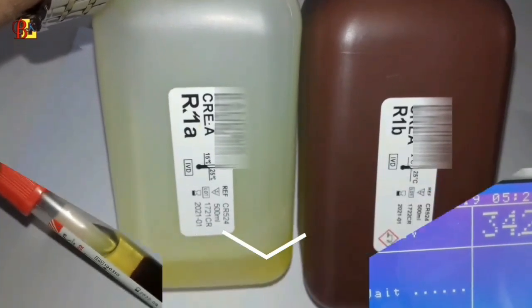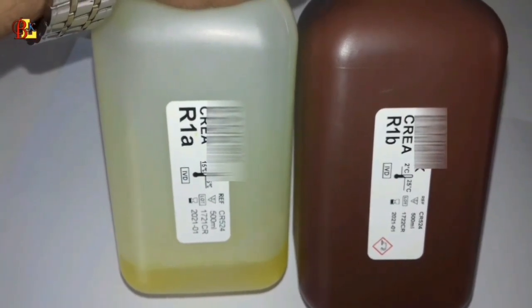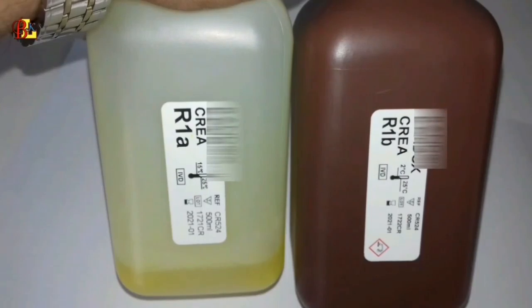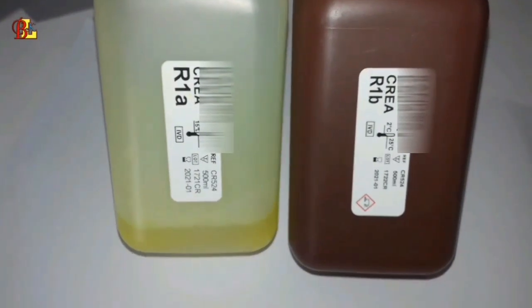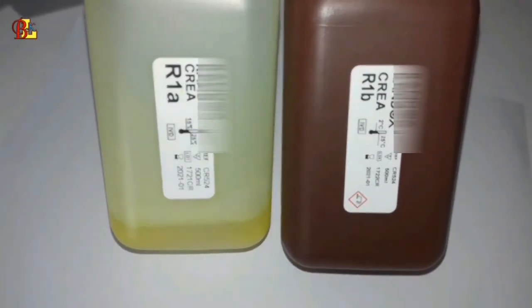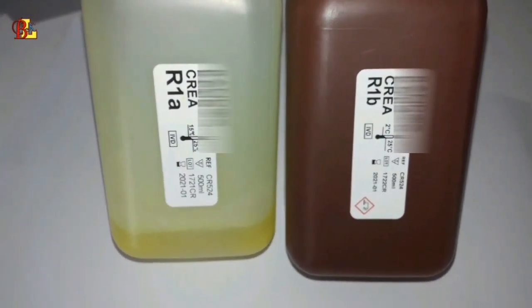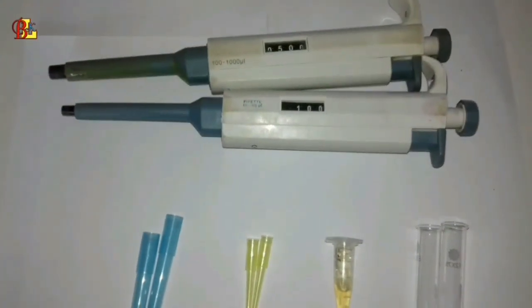To get started, the first thing we need to know are the instruments used in this test. The thing you see is the creatinine reagent. Take a good look at the reagents — R1A and R1B are written on them. We will do this test with both of these reagents.